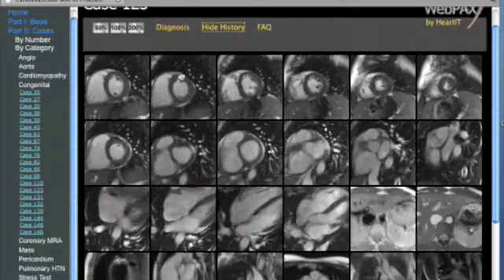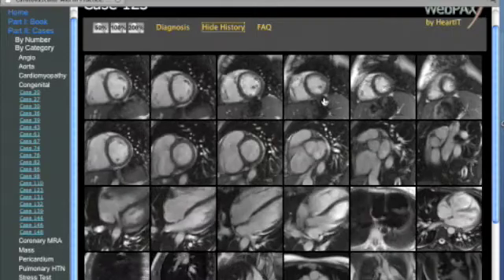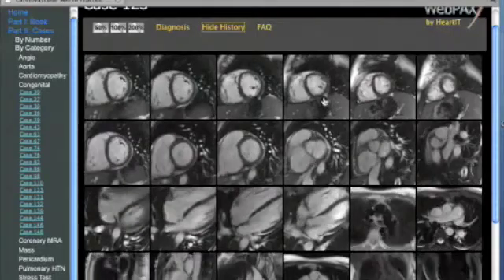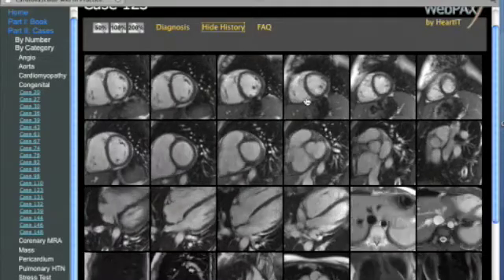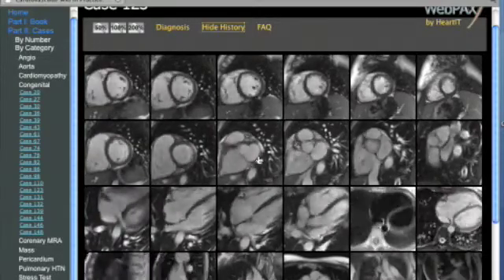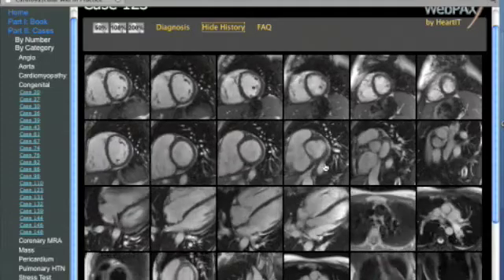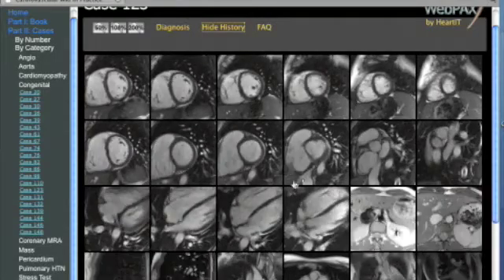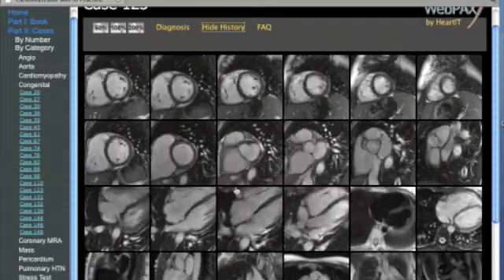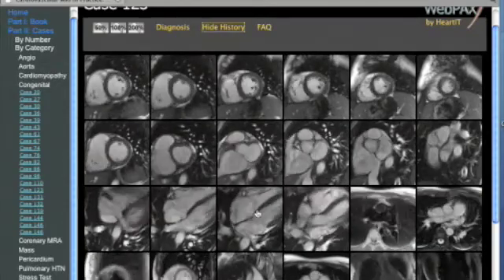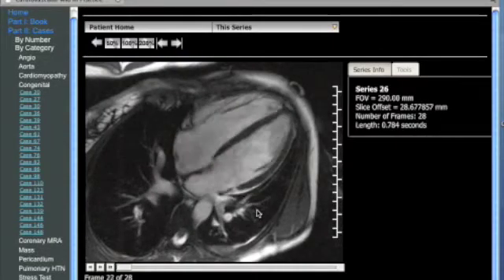Evaluation of the short axis images from base to apex confirms the suspected enlargement of the right ventricle. No apparent etiology is seen on initial evaluation, specifically no evidence of tricuspid insufficiency or pulmonic insufficiency of a significant degree. There may be a trace amount of tricuspid regurgitation noted on these four chamber images.